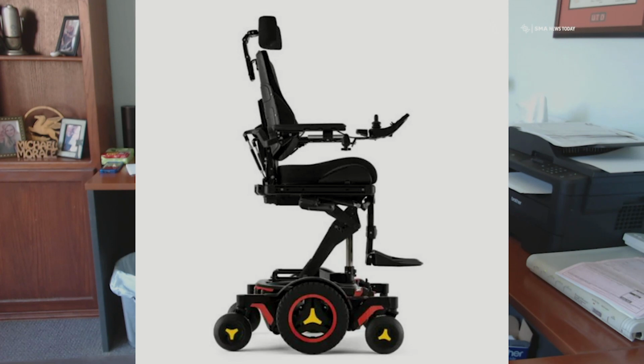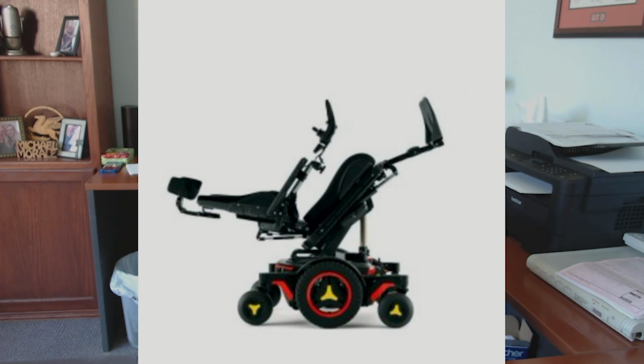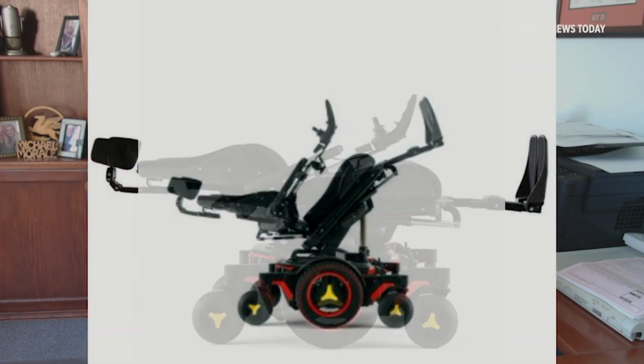Now, the only problem with me is that whenever I was growing up, all of the wheelchairs that were manufactured had sling seats and sling backs. So I've been sitting in a sling seat for over 54 years. I'll be 55 in August. And in that time, sitting in a sling seat has done a lot of damage to my hips. They didn't have the hard pan seats that these wheelchairs have today. Well, the problem is for me to go from a sling seat to a hard pan seat, it's very difficult because my hips are not used to that.